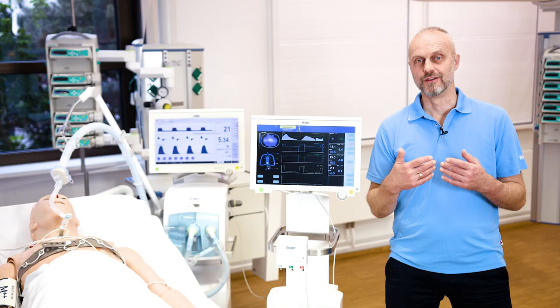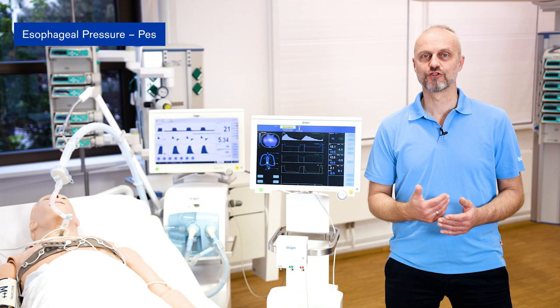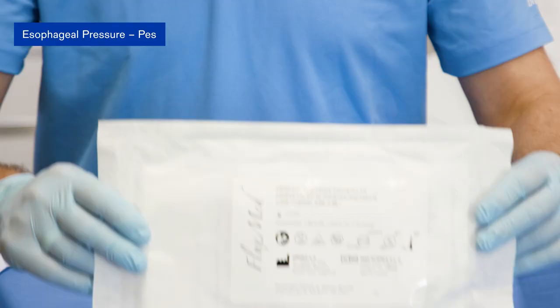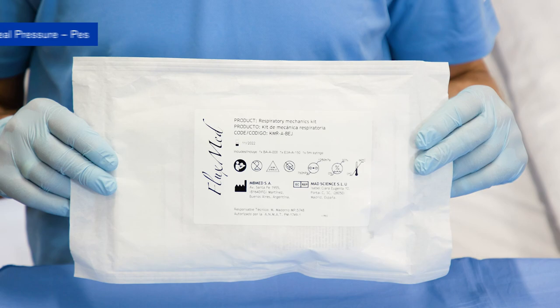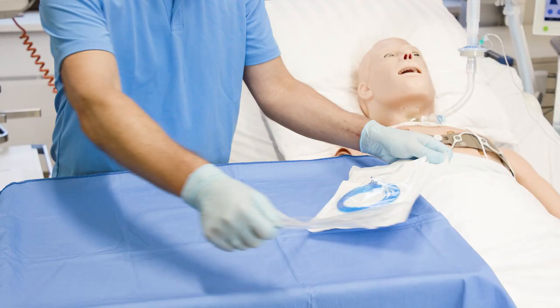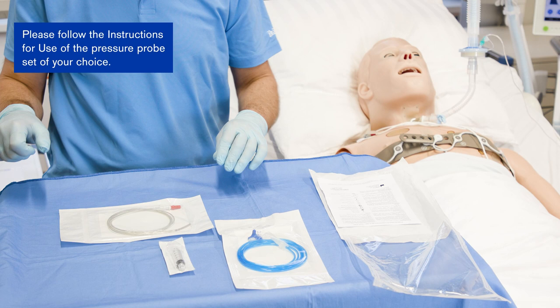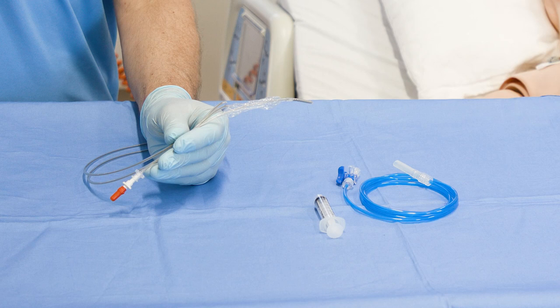Now we prepare the measurement of the esophageal pressure. In this tutorial we use the FluxMed respiratory mechanics kit, which contains the probe with a guide wire already in place, a syringe, and an extension line that is already connected to a three-way stopcock. Depending on the pressure probe being used, lubrication of the guide wire is required prior to its insertion.